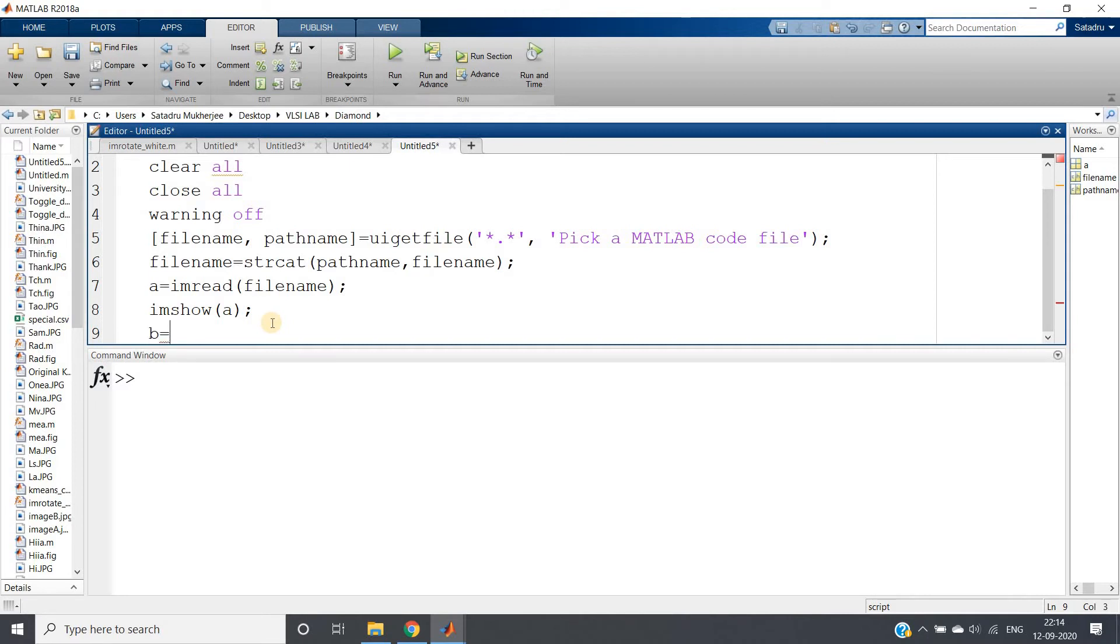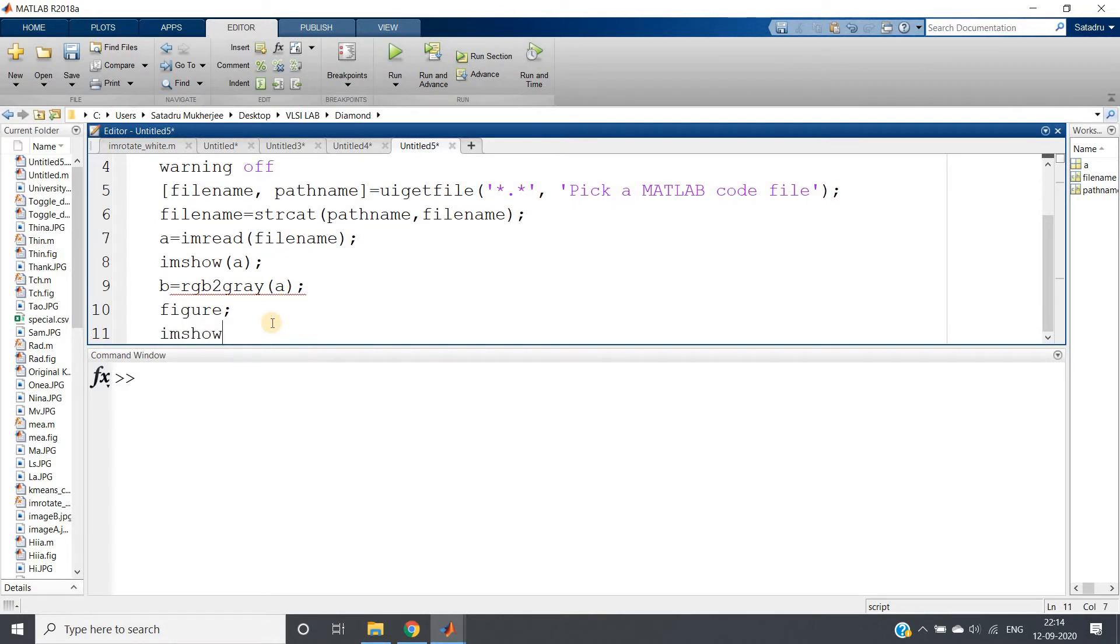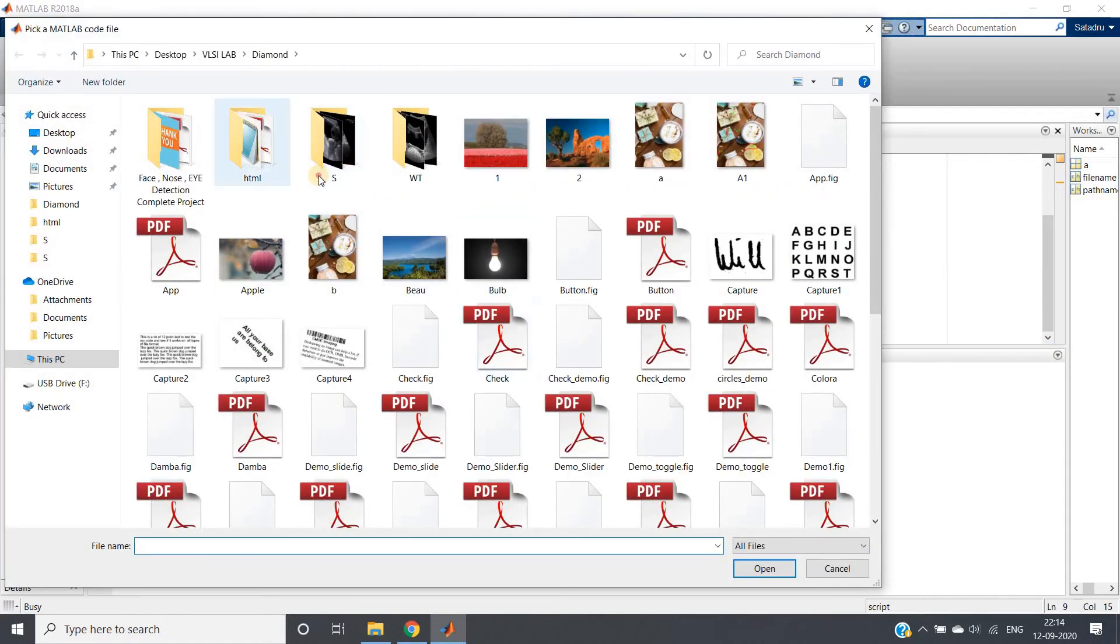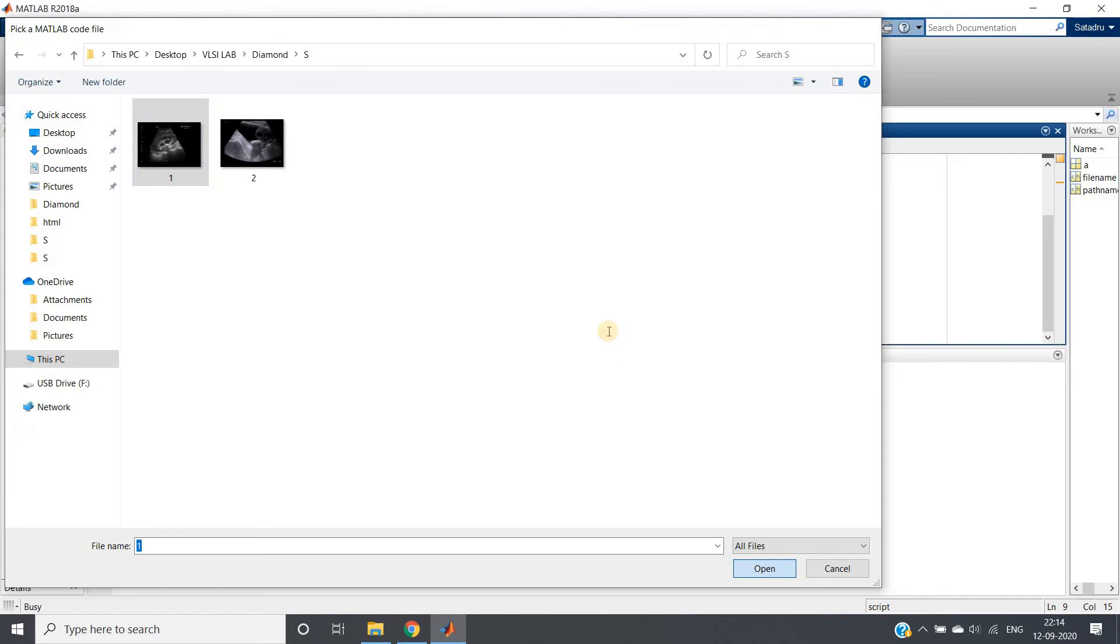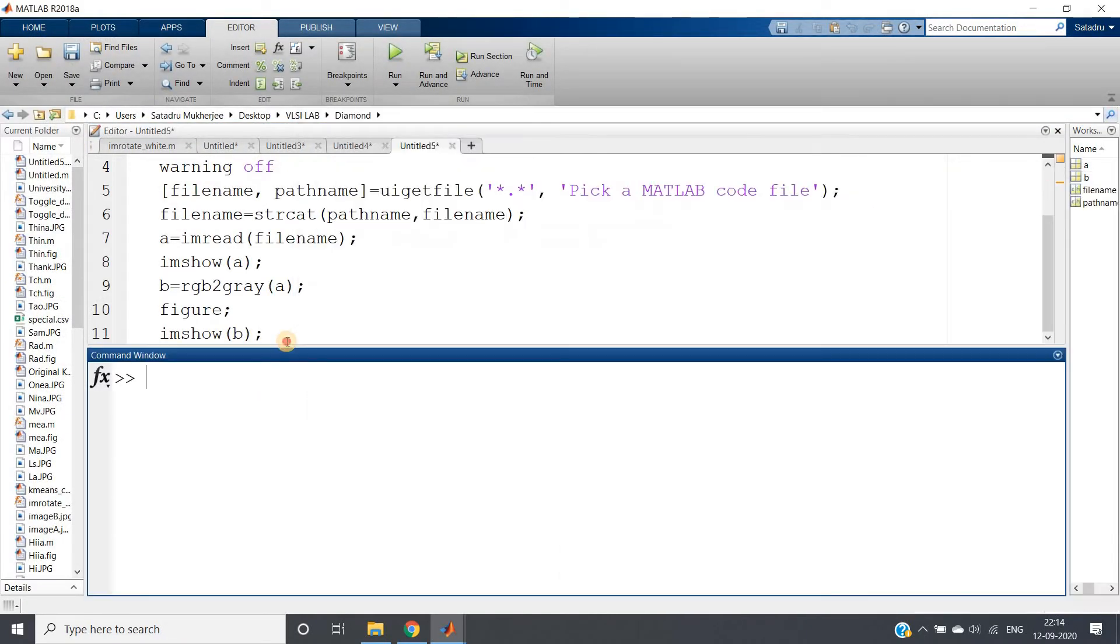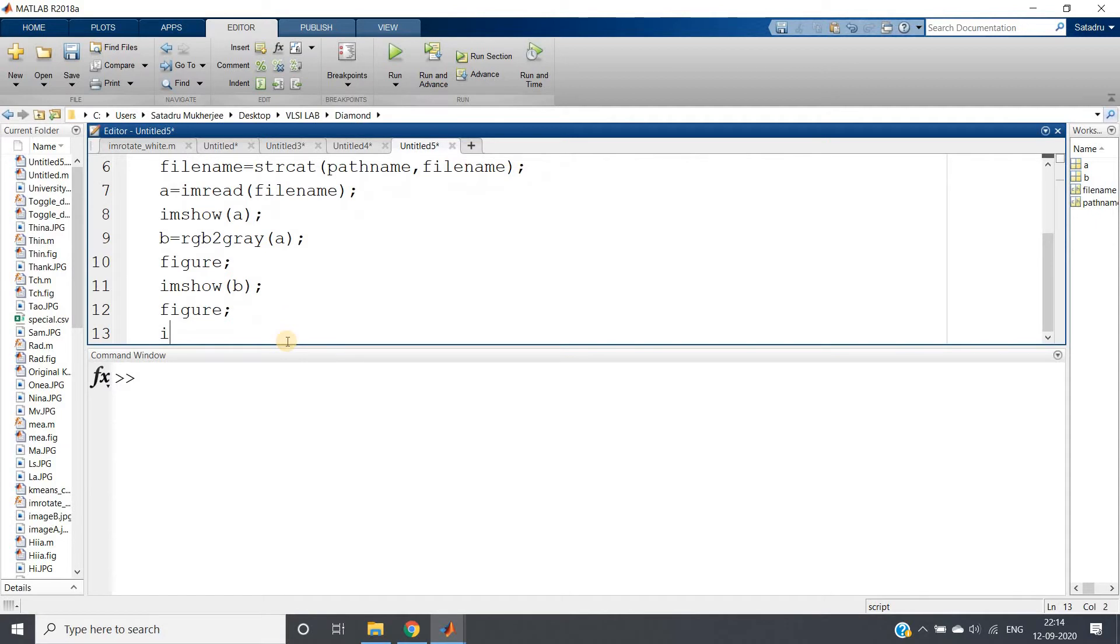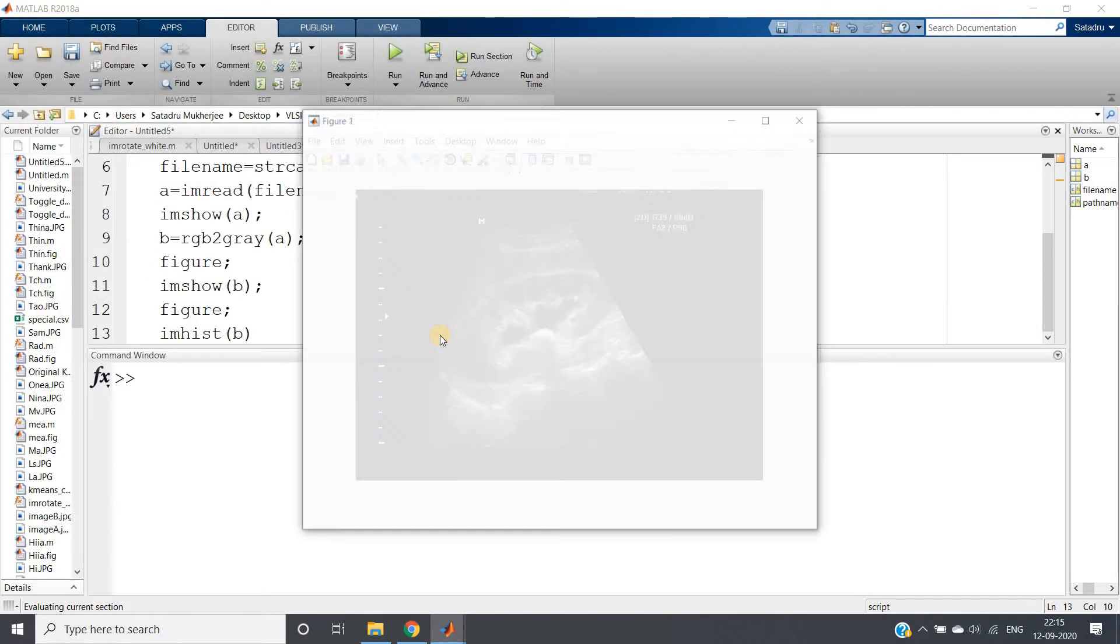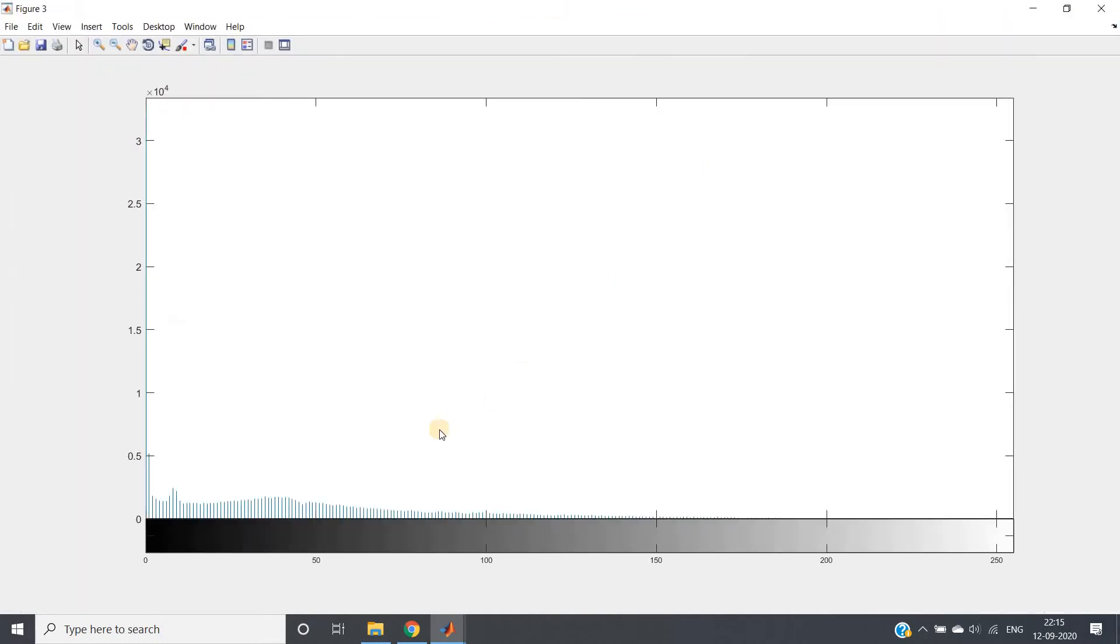Right so B equal to rgb2gray A. Okay and then applying figure imshow B. Okay let's check. Obviously you will be not getting any difference between RGB image and grey scale image because here in the RGB image also there is no coloring. Right so now what we can do we have to convert this image to our binary image. Now binary image let us check the histogram first. Figure imhist of B.